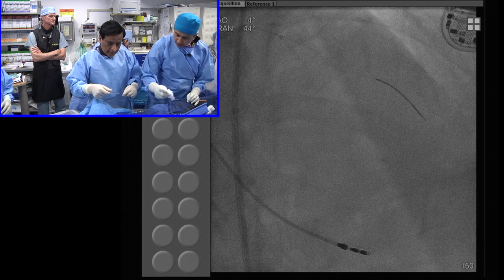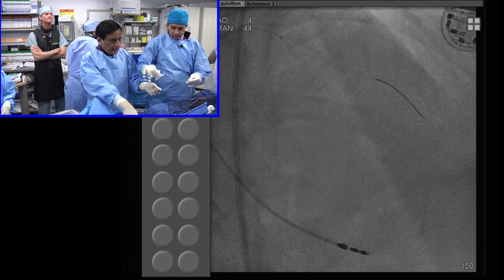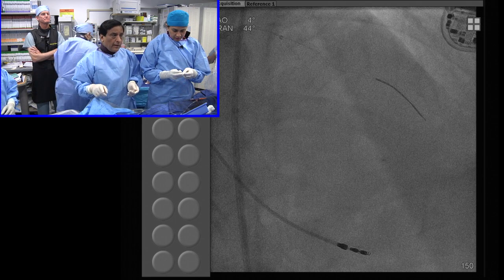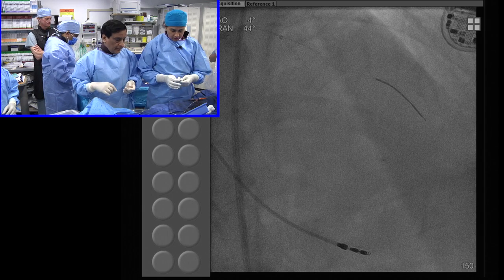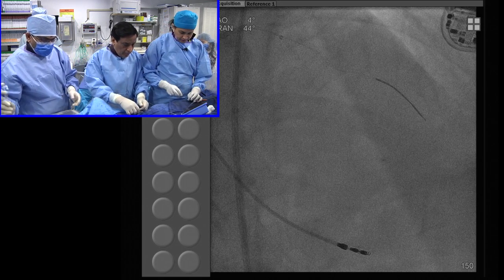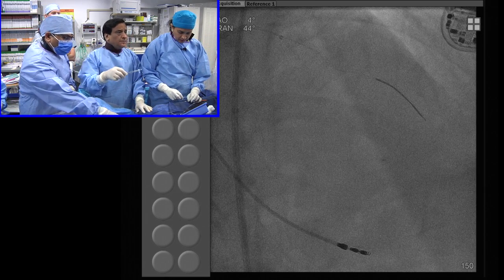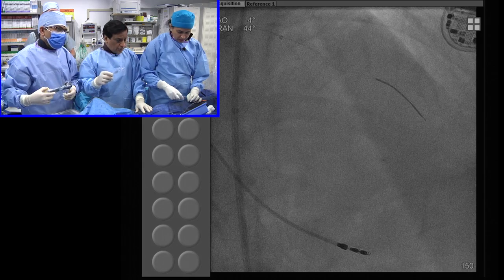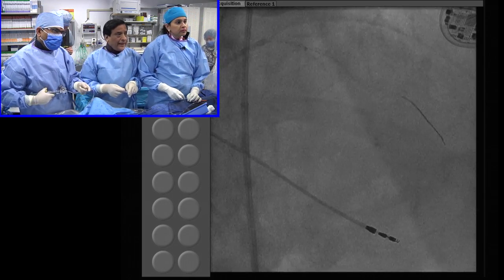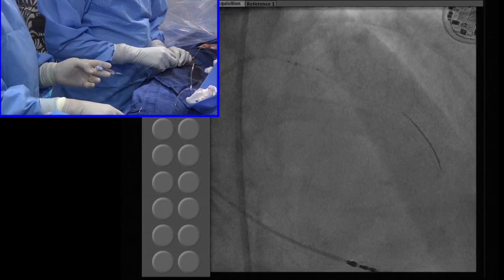We have here quantum apex 2.5. So now what we have done is we dilate that and then go back to exactly the 2.5 distal, and we have the guideliner. So in these cases, what we have learned is that guideliner really helps you to deliver with less push and pull, causing the deep throating of the guide and guide induced issues. So we have a very low threshold. Even if you put both the wires to the guideliner, that is what we have done. We need to advance the guideliner a little more.